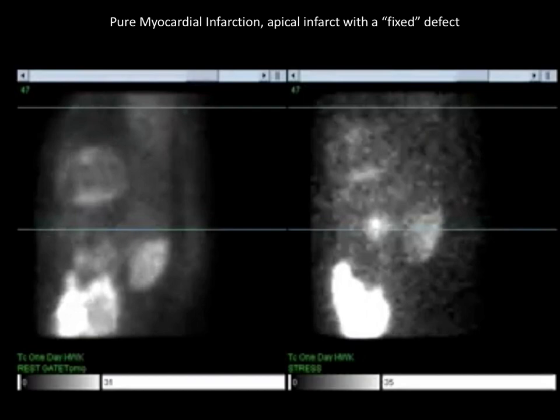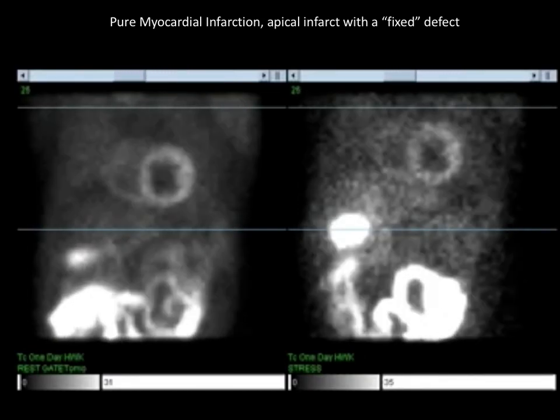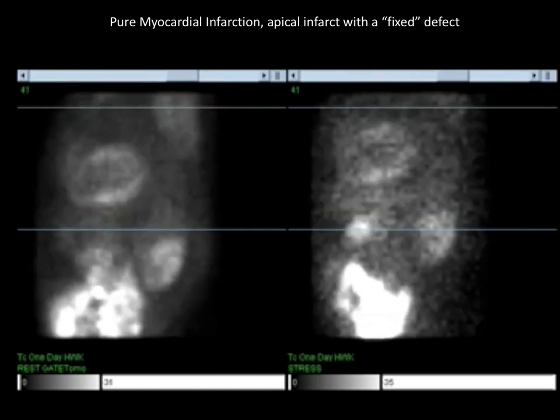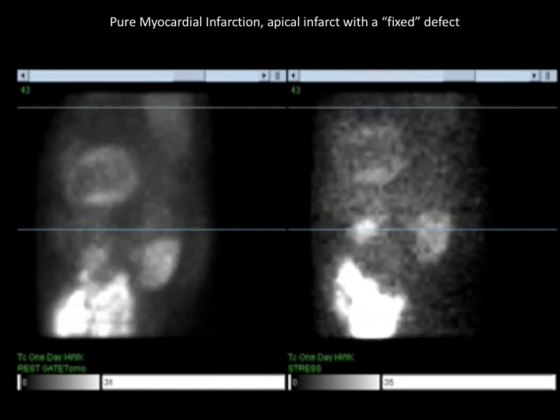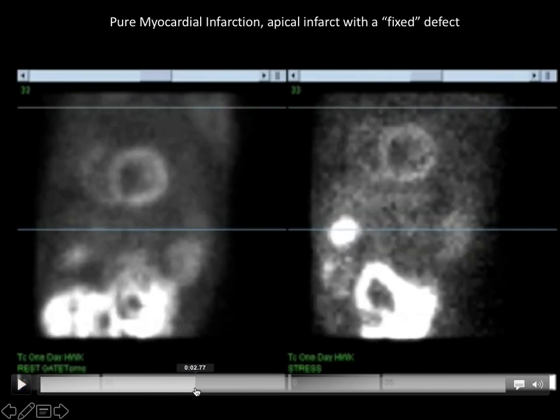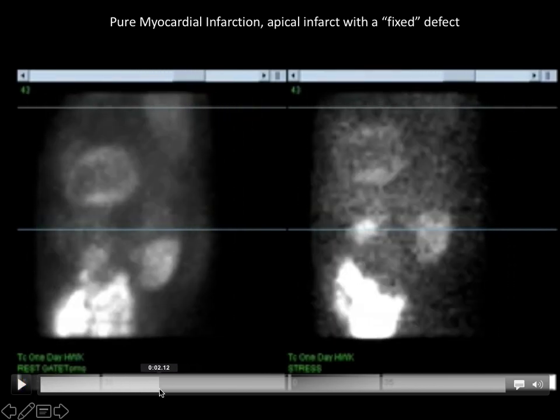So what's missing from this heart? Here I'm looking down the barrel, I rotate the patient, and we're here. Let me pause this and get it. In that view, what do you think's missing at this point? There should be like a cap right here, right? So this has kind of been cut off.